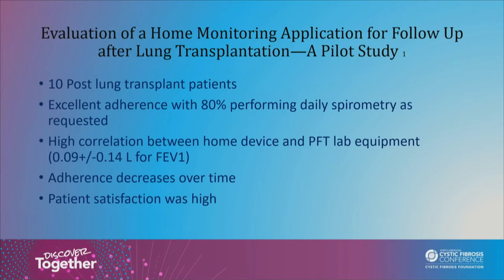One patient was hospitalized with complications, and it's kind of like you get your new device, you get your new toy, you're going to use it all the time, and then after a while, you feel good. It's one more thing to do, so you end up not using it as often as you're asked to. But the patients really liked being able to keep track of their lung function. So these are some of the things that point us towards these are good things to have for our patients.